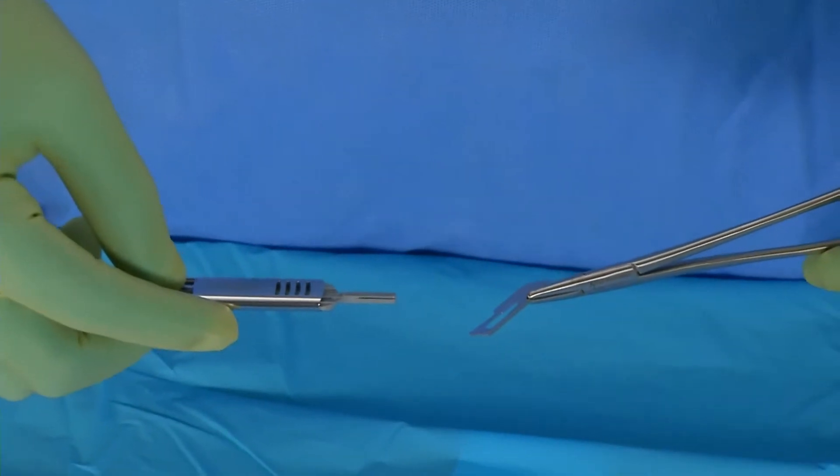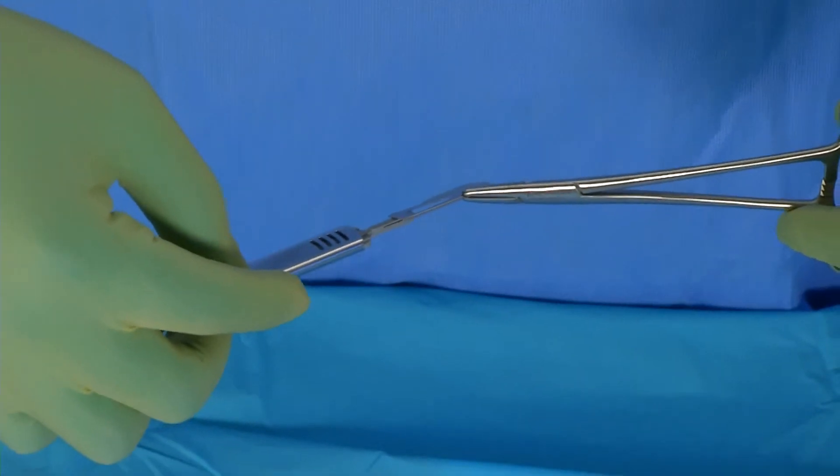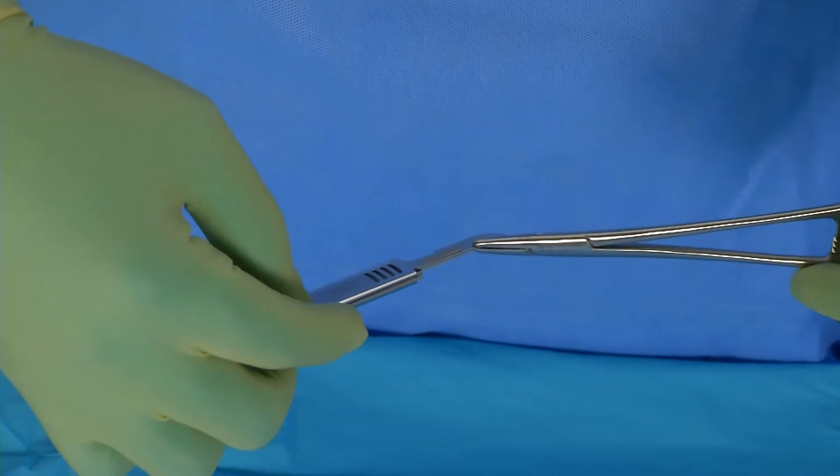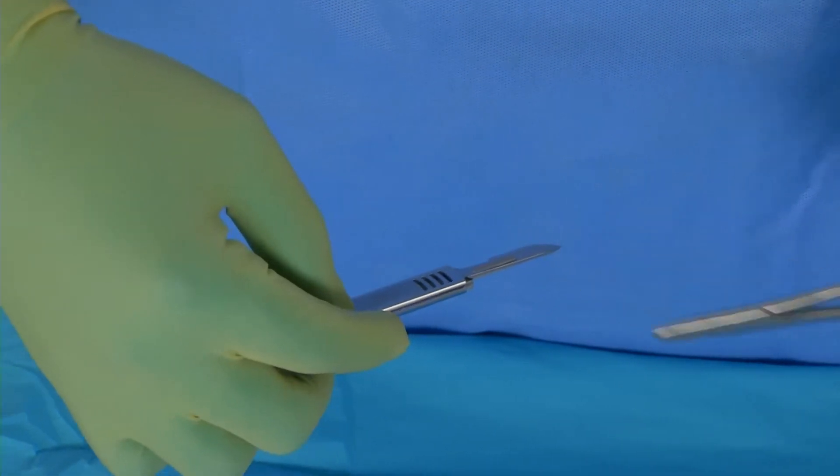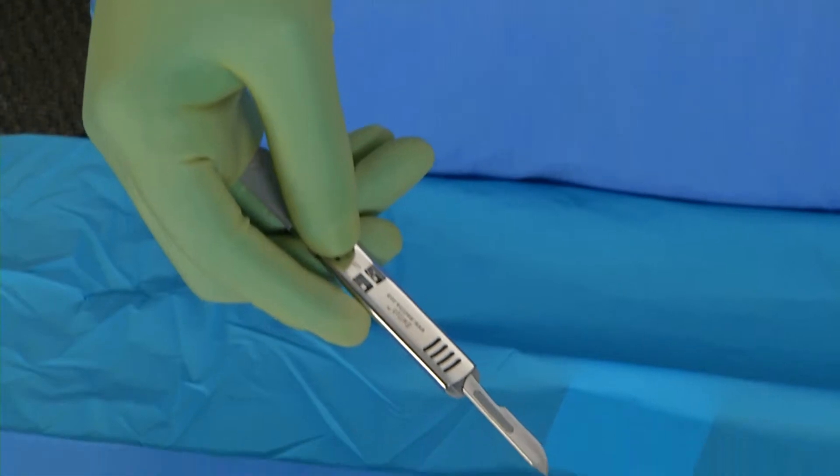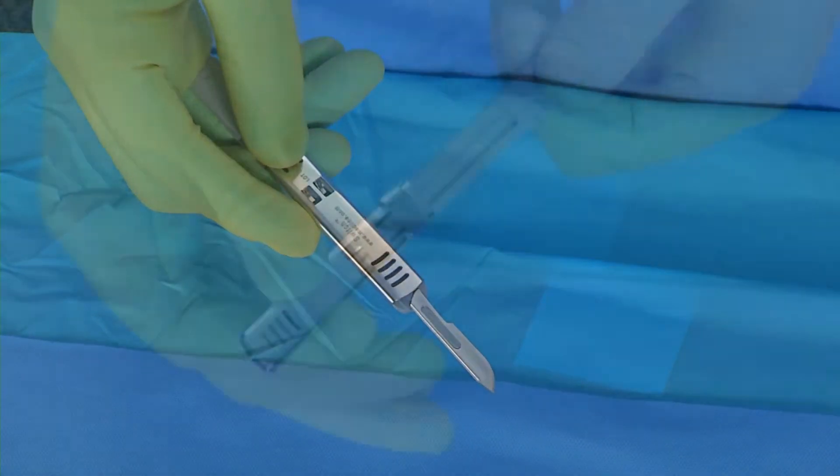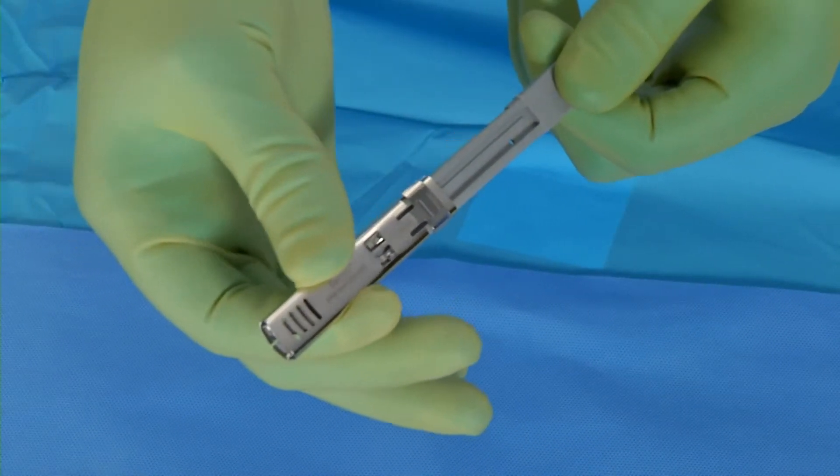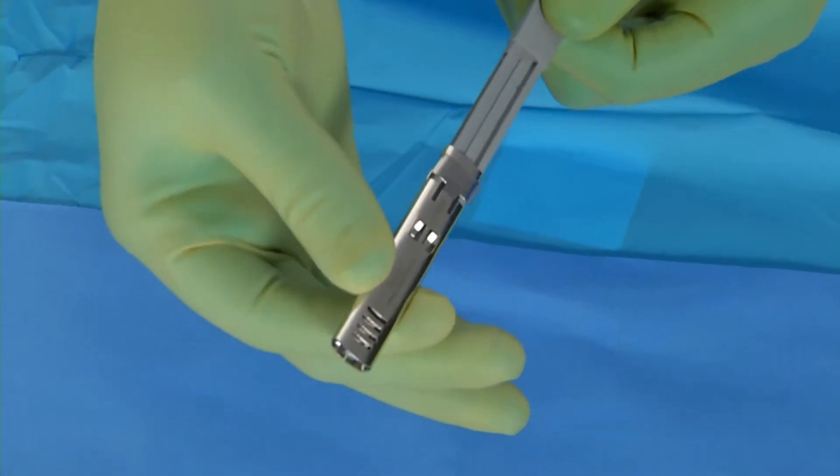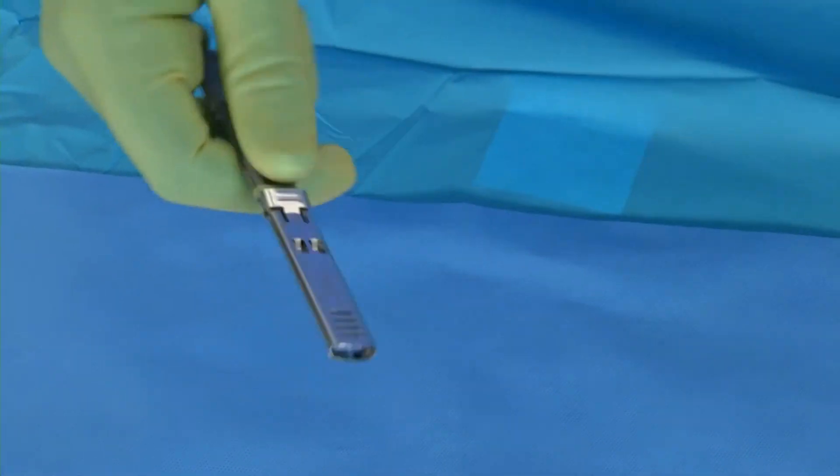To use the switch, load the blade to the handle using normal safe techniques. Press the same button to move the shield backwards into the rear lock position to use the blade.